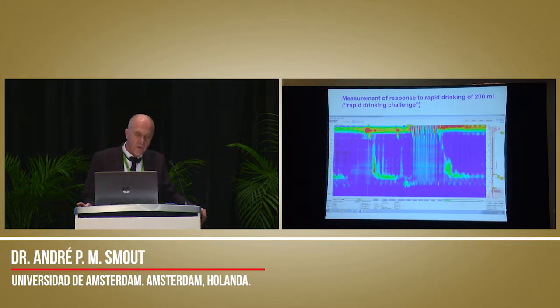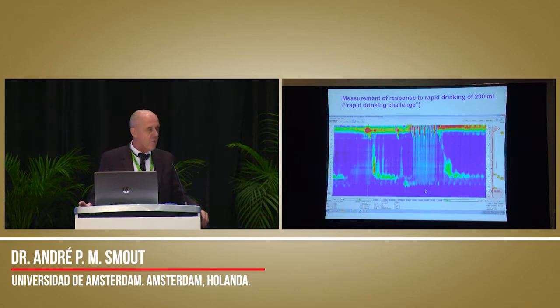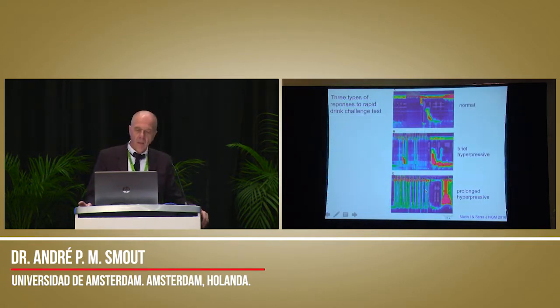What we also do nowadays is doing the rapid drinking challenge. That is giving 200 mL at the end of the investigation. We let the patients drink this if they can. And we also don't know what to do with it yet. We don't use it clinically yet, but it is for future reference.